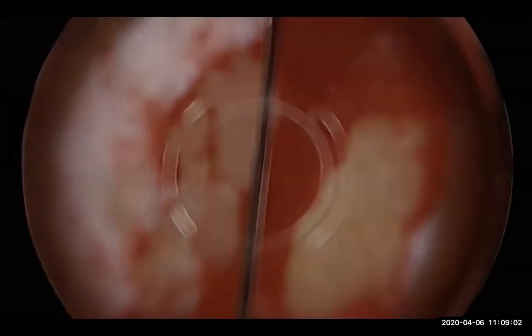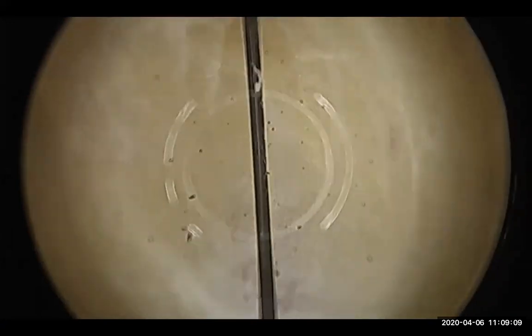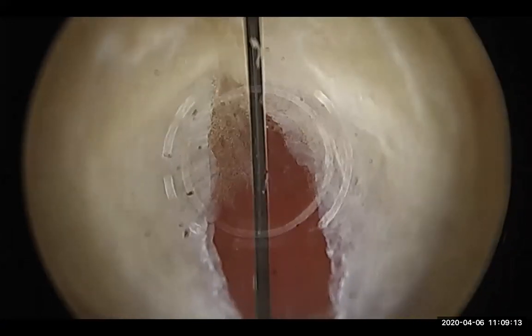Let's talk about the eTEP RS as an operation here. Now, this is a Visiport. This black line is the knife. This is subcutaneous tissue, and you can see we have incised the anterior rectus sheath. The rectus muscle comes in. We just move it. We split the muscle, and we can see the beginning of the posterior rectus sheath.